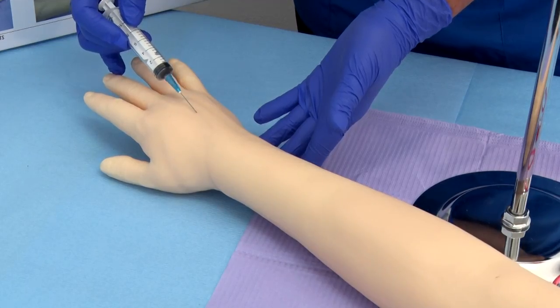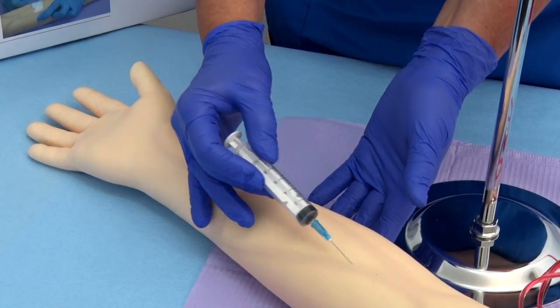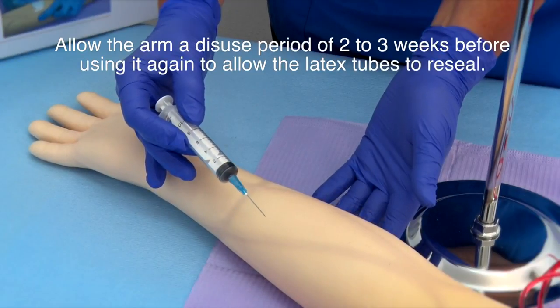Hint 4: The latex tubes tend to reseal after a needle stick. After a fair amount of use, the arm will start leaking, initially very slightly so.